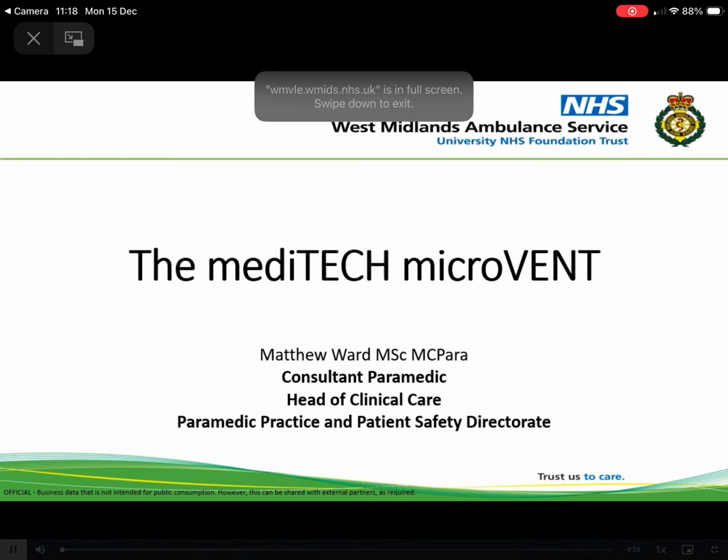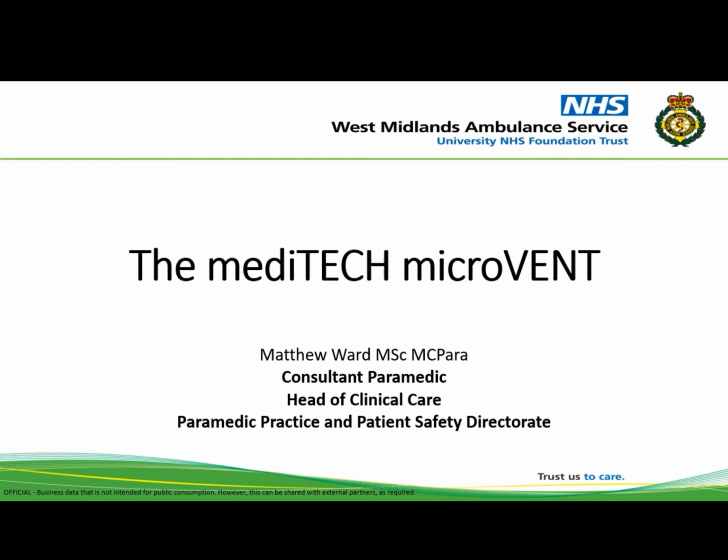Hi, I'm Matt Ward, a consultant paramedic and the head of clinical care. This presentation is to introduce the Meditech MicroVent.